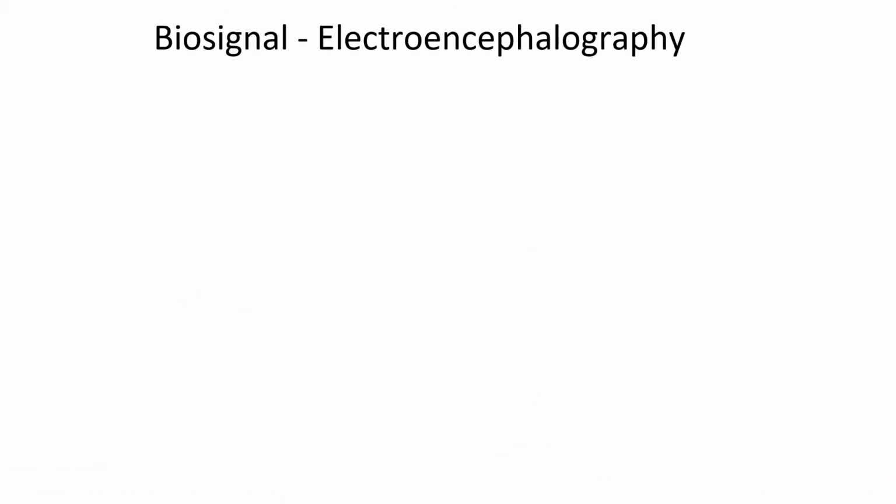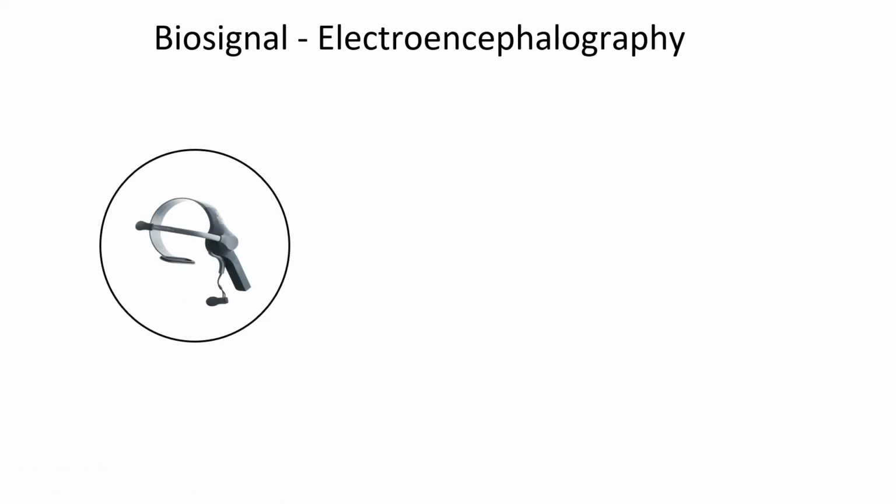Now, moving on to our second module, we worked with EEG, which is electroencephalography. We are using NeuroSky EEG headset to acquire the brainwaves. Some of its technical specifications are 12-bit raw output spectrum ranging from 3 to 100 Hz, sampling rate of 512 Hz, automatic Bluetooth pairing. This NeuroSky headset gives a variety of processed as well as raw brainwave signals.